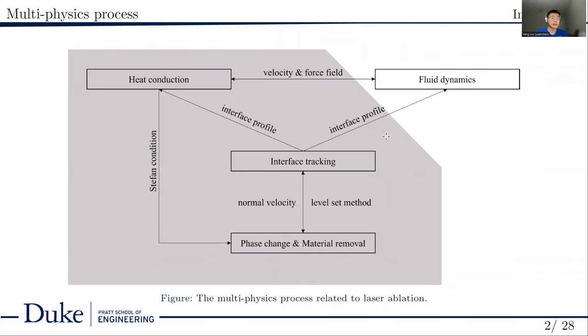The underlying physics of laser ablation mainly includes, firstly, the heat conduction. The laser energy is absorbed by the stone sample, and then there is the interface tracking and the phase change or the material removal. In this work, fluid dynamics and fluid interaction are not considered, to simplify the problem.